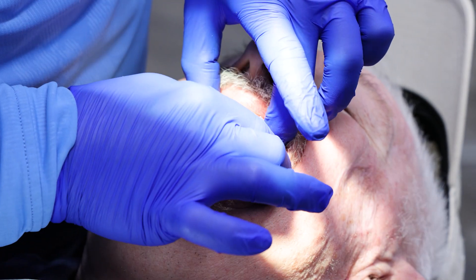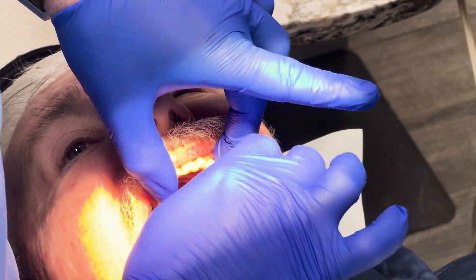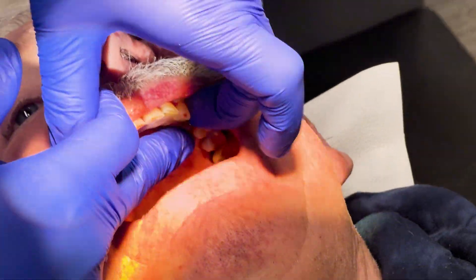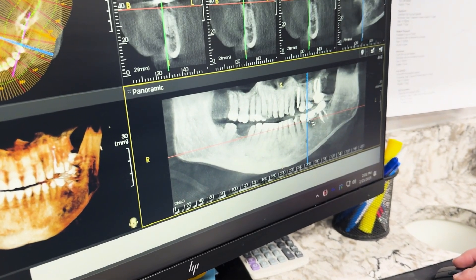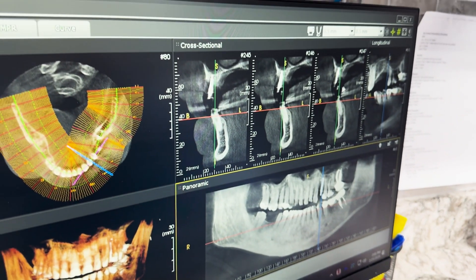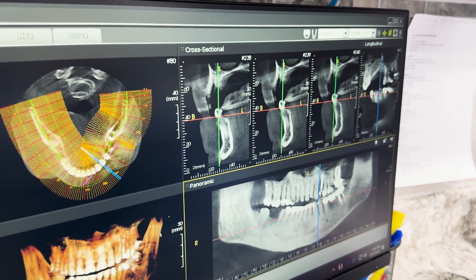I also like to tighten it with my fingers, and that gives me another tactile feel of how tight that implant is. If you can't move it with your fingers, that indicates it's pretty solid and in bone. I'm able to move it a turn or two, and I'm able to hand torque about 30 Newton centimeters — I tested that at a mid-winter meeting. There's your implant right there. We will take a CT and then I'll show you guys the final result. There's still some bone filling in around, but I was able to catch that area mesial to tooth number 13 and get it in some good bone. That 13 millimeters was the right mark right at the dip of the sinus, and we're just going to give that a little time to heal so that bone can fill in around the implant.